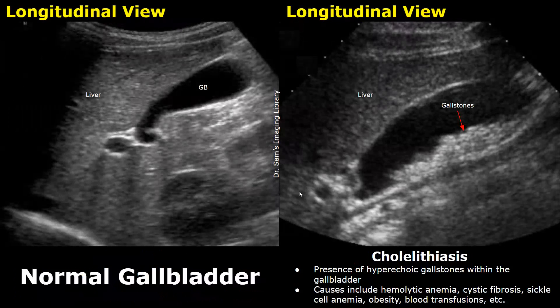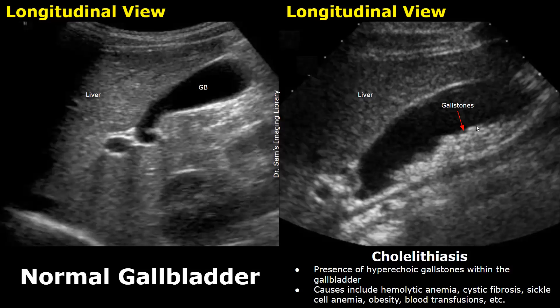This image shows a normal gallbladder in a child in longitudinal plane. The image on the right is a case of cholelithiasis, or gallstones. In children, gallstones can occur due to hemolytic anemia, cystic fibrosis, sickle cell anemia, obesity, blood transfusions, and other causes. Hyperechoic gallstones will be seen within the gallbladder with associated posterior acoustic shadowing.